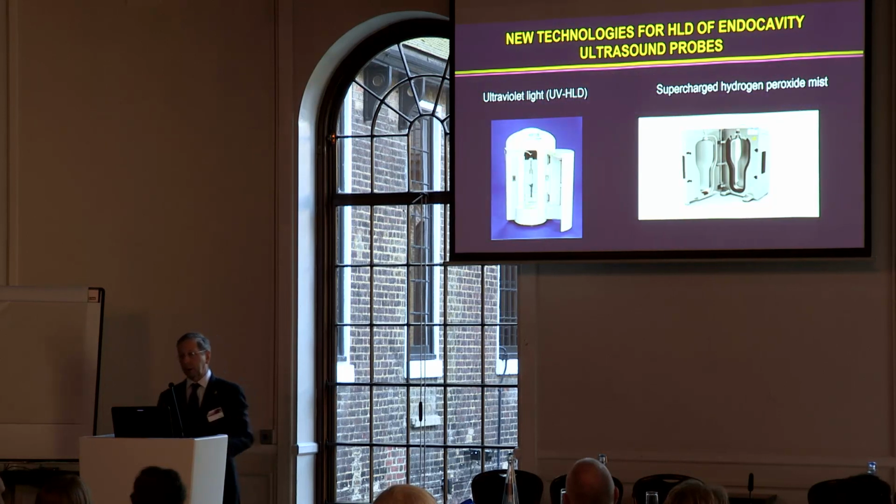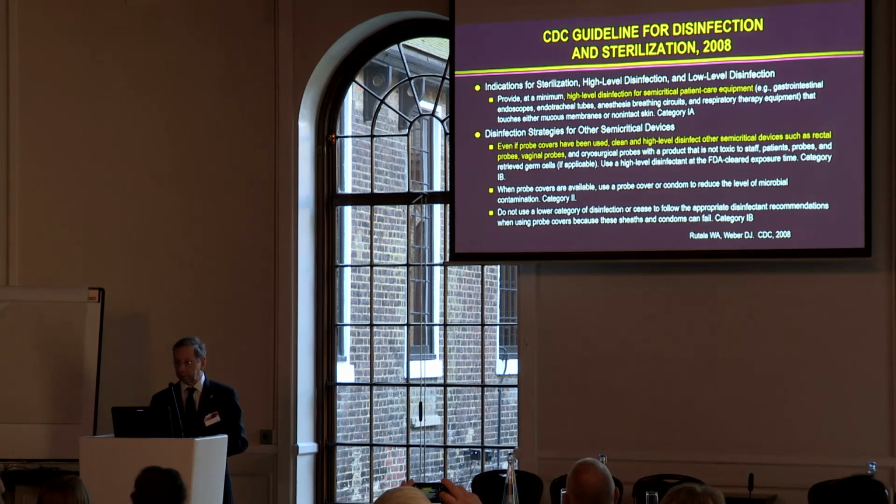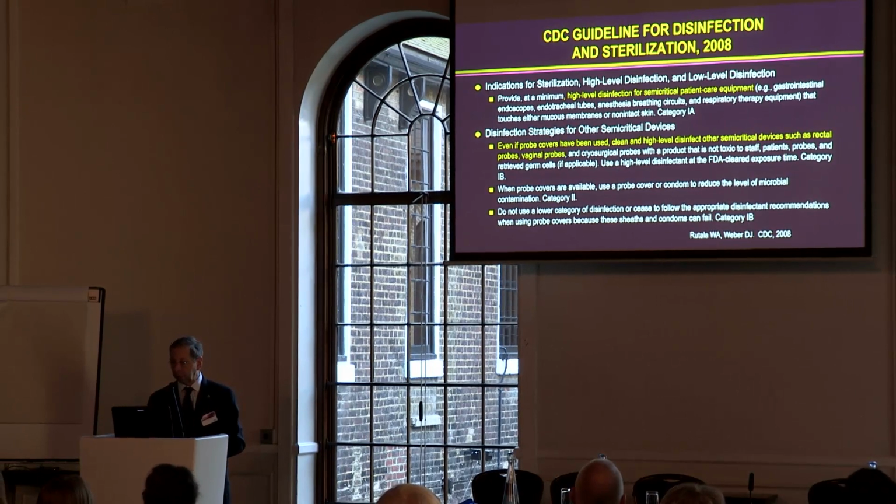So what are the newer technologies we can use? One is a supercharged hydrogen peroxide mist. Another is ultraviolet light. Both of those are virucidal and bactericidal. The CDC guideline, as I've said, provided a minimum of high-level disinfection for these probes. Again, even if probe covers have been used, clean and high-level disinfect semi-critical probes as part of the guideline.